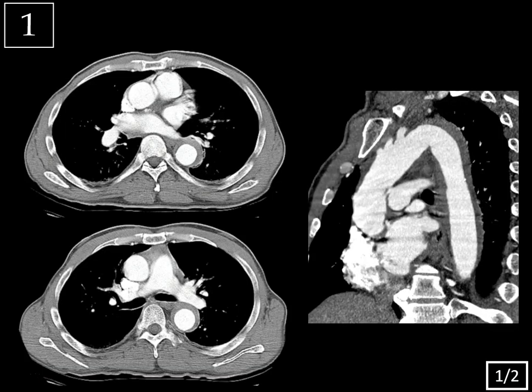On these contrast-enhanced images, you can see that there's a hypodense rind of soft tissue surrounding the descending thoracic aorta. You might initially think that this is mural thrombus, but notice how smoothly marginated it is. Also, on this coronal oblique reformatted image, it extends the length of the descending thoracic aorta, which would be very unusual for mural thrombus, and again, it's very smoothly marginated.